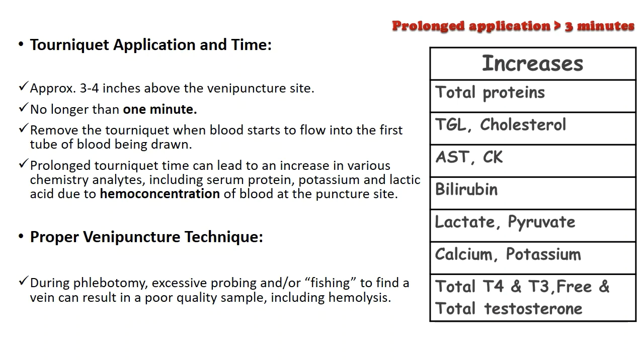There is no need of that, because if you keep the tourniquet more than 3 minutes, not only is it painful, it may cause inflammation of the area, but also there is false elevation of total protein, triglyceride, cholesterol, bilirubin, lactate, etc. Moreover, the coagulation system will be activated in vivo, and there will be false results of prothrombin time, APTT, etc. There is chance of lysis also, RBCs will break down, and there will be a false low platelet count.